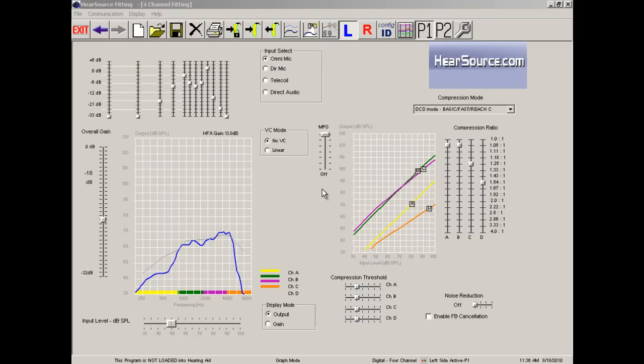Hi, this is Aaron with Hearsource.com. Today we're taking a look at the Hearsource fitting software.